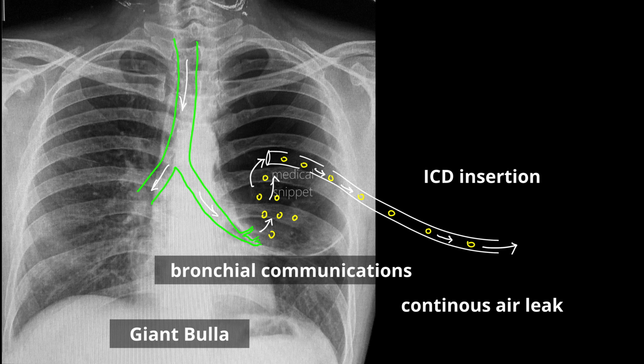So if in doubt, always do a chest CT to differentiate between these two conditions.